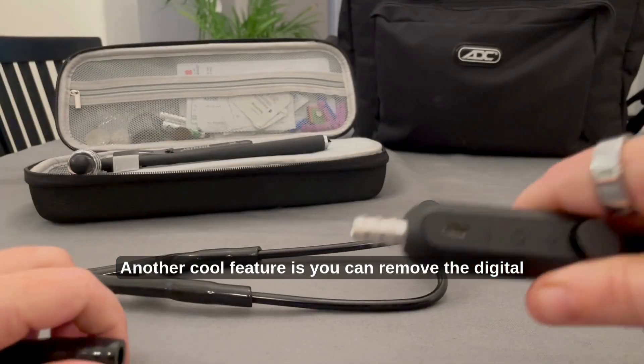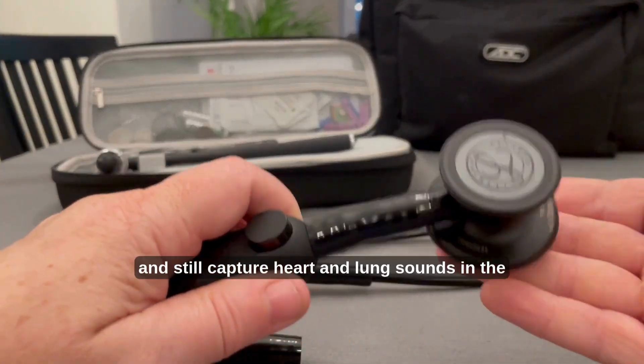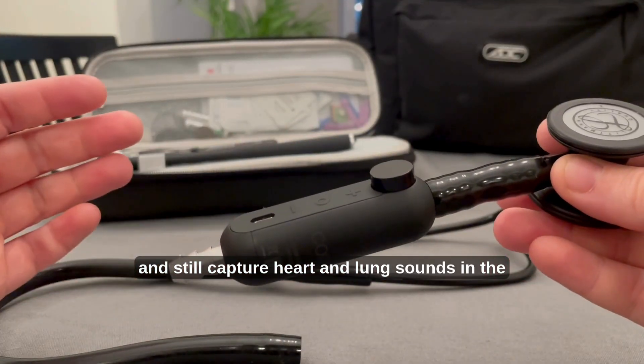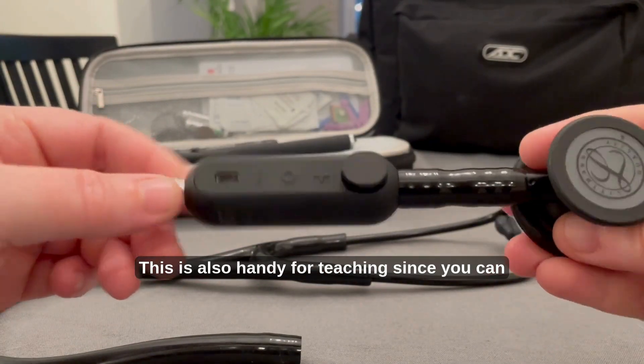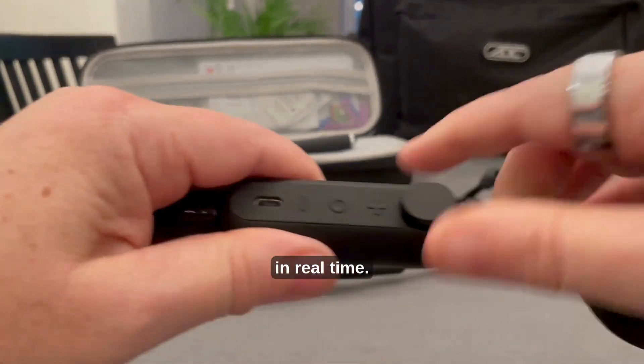Another cool feature is you can remove the digital stethoscope portion from the tubing and ear pieces and still capture heart and lung sounds in the app. This is also handy for teaching since you can connect a speaker to your phone to play the audio in real time.